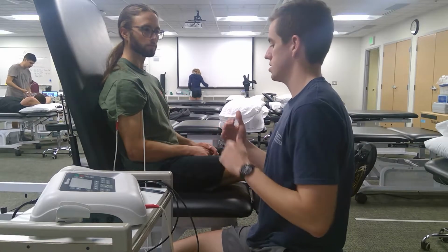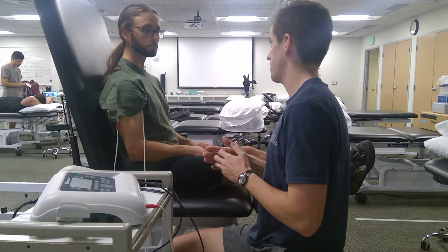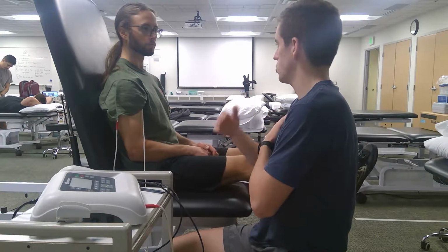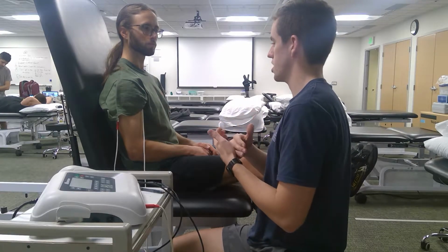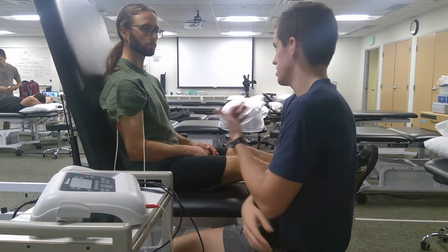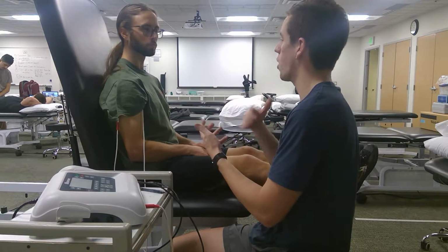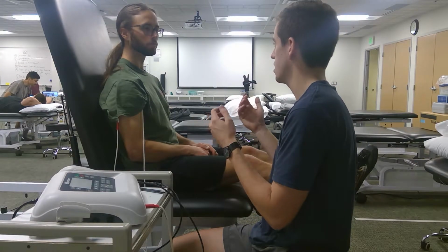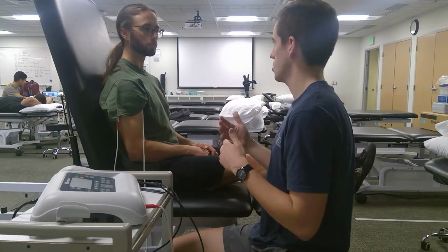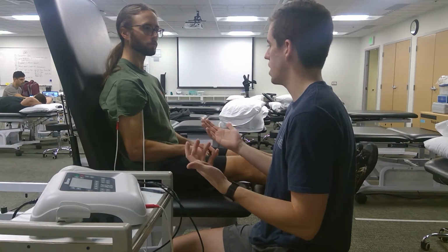And basically what we're doing, to explain to you, is we're stimulating what's called an A beta nerve. And what we're trying to do there is send a whole bunch of tingling signals to the spinal cord and to the brain. We're basically trying to send more signals than the brain can take, because right now you're getting pain signals and you're getting tingling signals, right? So by sending more tingling signals than pain signals, we're overwhelming the brain with those light tingling signals so that you're not experiencing that pain. And that should also help to calm down the pain signals, so that after the treatment, you're also not receiving as many pain signals to the brain, allowing you to be pain-free.